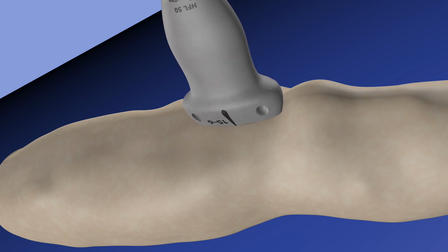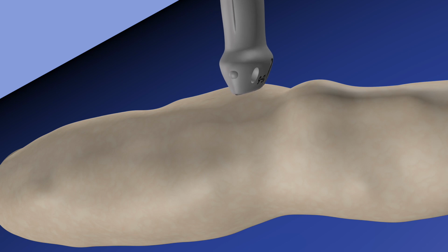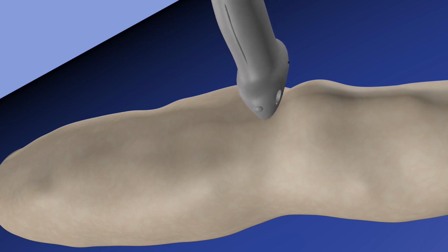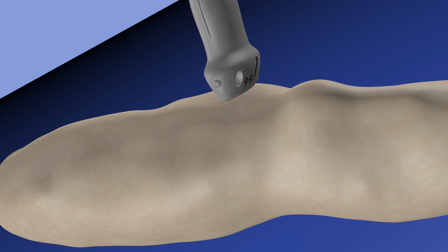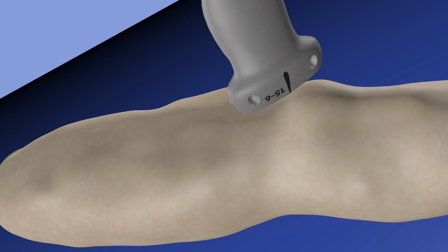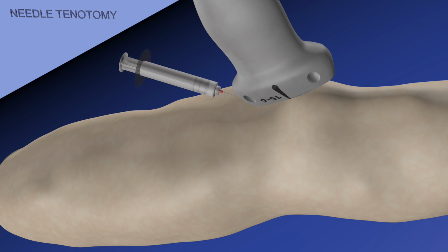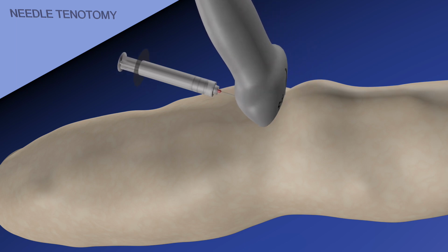So here's our lower extremity. We can see our probe in a sagittal plane going from medial to lateral and back to a medial orientation, and now we're switching to an axial plane where we're trying to cover the entire quad tendon. And here we are rotating back to the sagittal plane, starting with lidocaine injection. We're essentially just injecting superficial to the quad tendon, and here is the beginning of the procedure of the needle tenotomy, where we're trying to fenestrate the tendon and break up some of that calcification in the distal quad tendon.